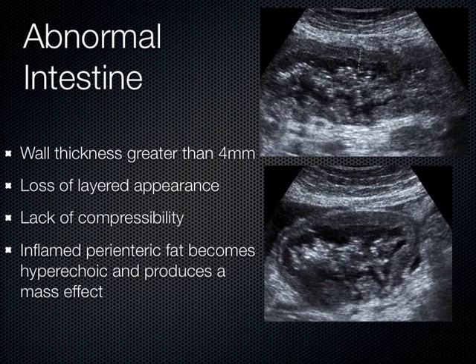Now, as you can see here, this is abnormal intestine. How do I know that? Well, I measured the wall thickness. We measure from the outside edge of the wall all the way down to where the lumen starts here. And this is where the lumen is here. This is like stool and feces and a little bit of air. These little punctate things here, that's probably air. Whenever I see dots on the screen, those are almost always air. And so the wall actually extends right to where the lumen starts, okay? So over here, the wall would start here, all the way down to where the lumen starts. In fact, down here, the lumen starts right about here, okay?